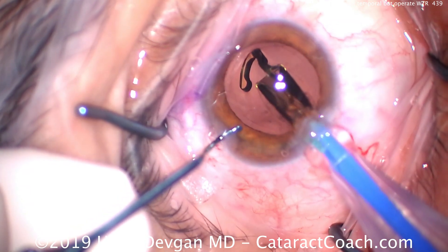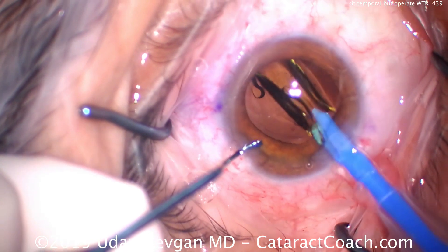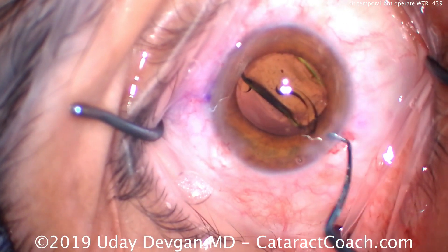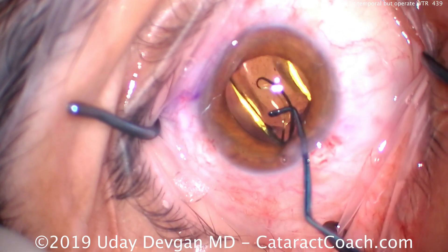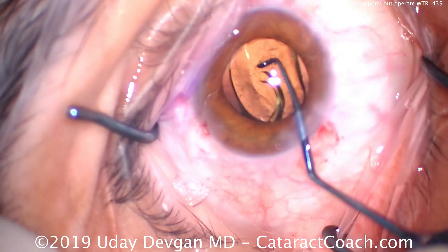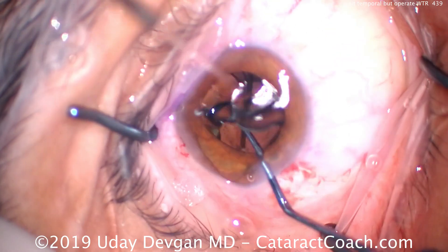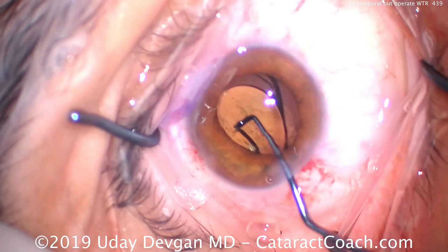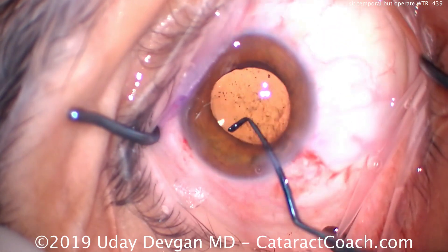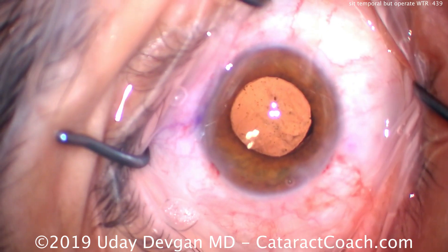We'll put the IOL in the capsular bag and look where our incision is — we're very much inferiorly, at about the seven o'clock position of the eye for that inferior incision. Yes, my hands are touching the patient's face through our sterile drapes. I tell the patient: don't worry if you feel me touching your cheek or your face, that's completely normal.